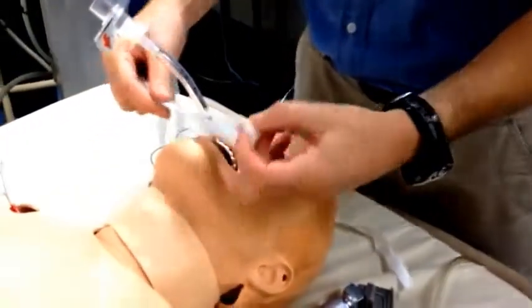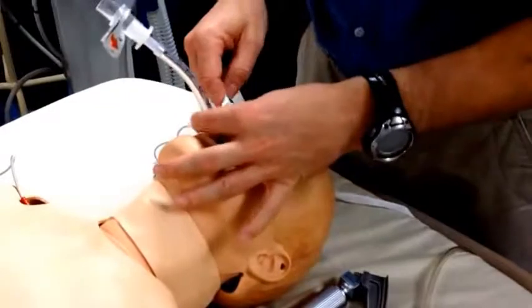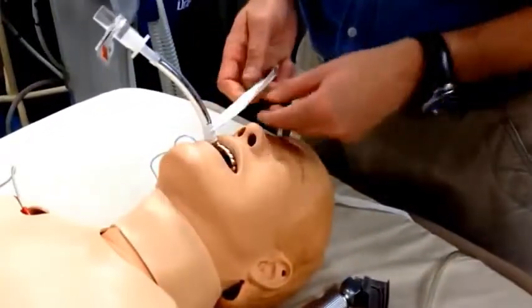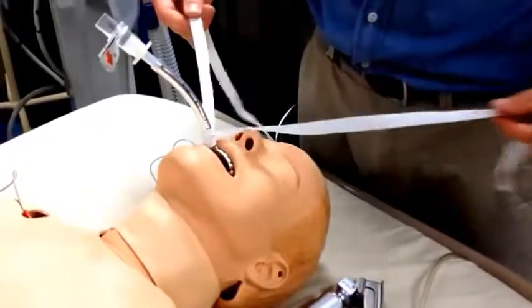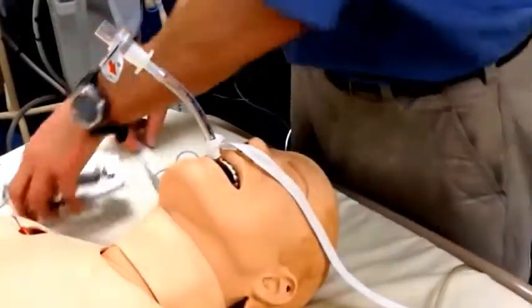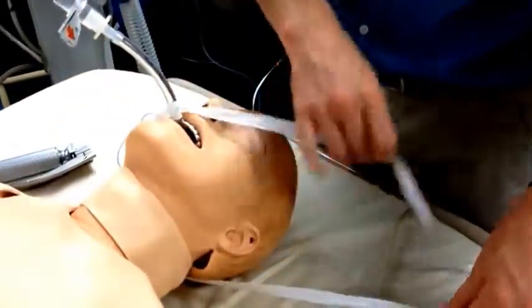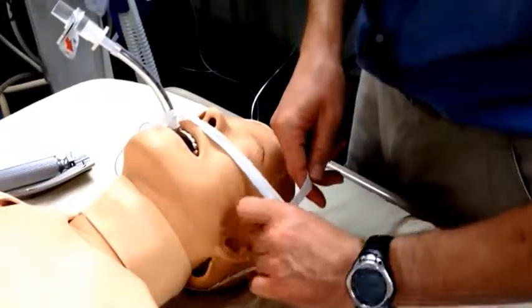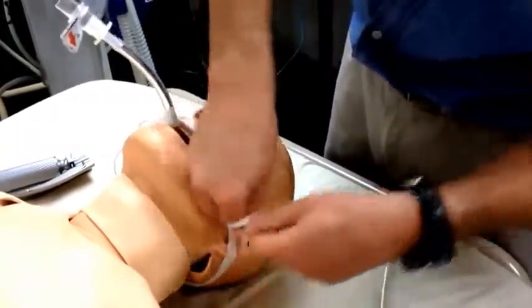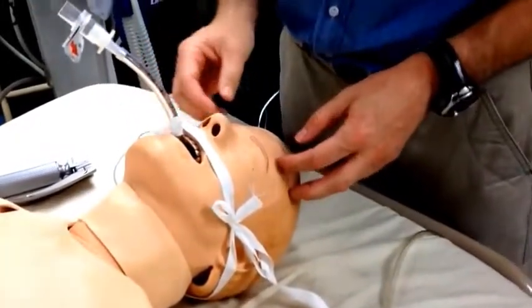Put the loop around and feed through itself. Seat it at the depth and tighten it around the tube to make sure that it is secure. You should now be left with a short end and a long end. Pass the long end of the tape underneath the patient's neck and tie a simple bow knot to the side of the patient's face. The tube is now held secure.